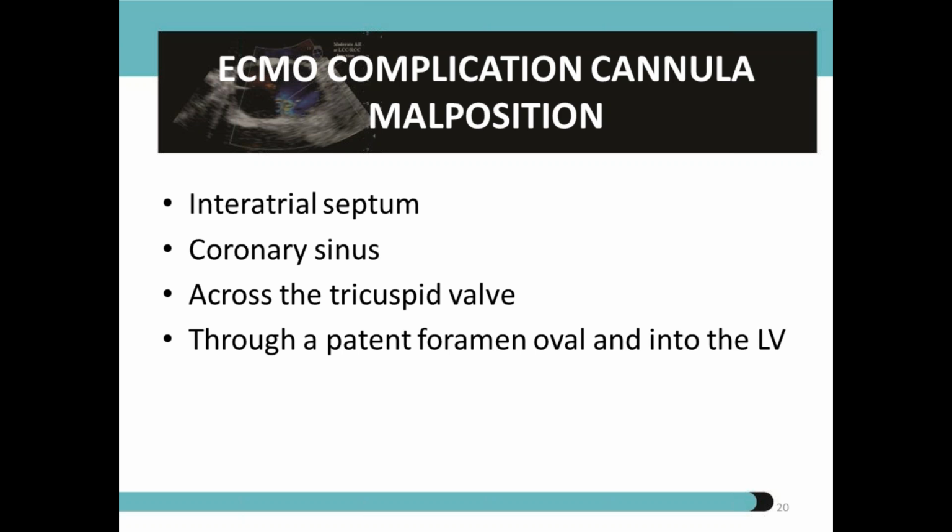In fact, it is your duty to tell the intensivist, before putting in the cannula, whether there is an LSVC. LSVC is an enlarged coronary sinus, so it's a posterior structure. So you see the LSVC and rule out its size. If it is present, do not put a cannula in the RA. Then you do a veno-venous femoral access, that's better.